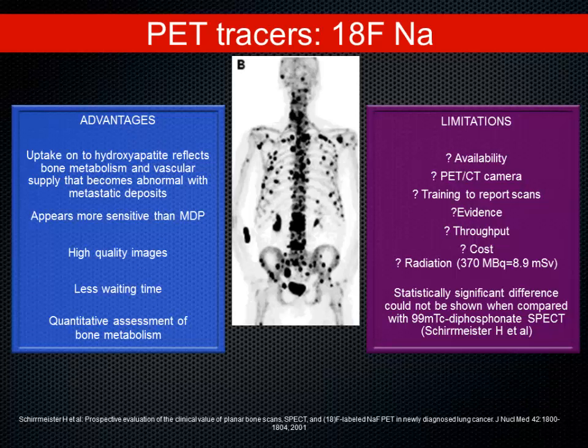trials where we do a bone scan every 3 months. Every 4 months, the patient has a bone scan as well as a CT scan. And if you're going to fry these patients with 15 millisieverts every 3 months, that's going to be a problem. It's not going to be a problem from the imaging point of view, but our partners in practice, the radiologists, have an edge to promote MRI, which is going to be a gold standard. There is a paper recently, about 2 weeks ago, which says MR can do everything. You don't need a bone scan, you don't need a PET scan. It can change the whole way prostate imaging is done, quite drastically.